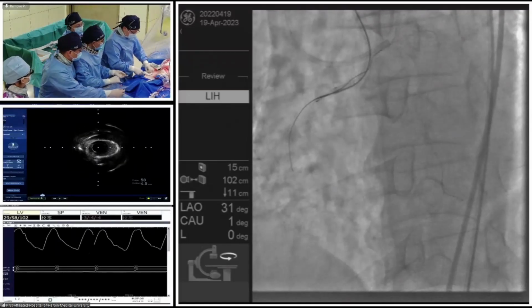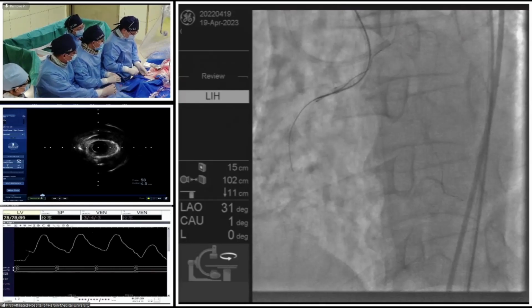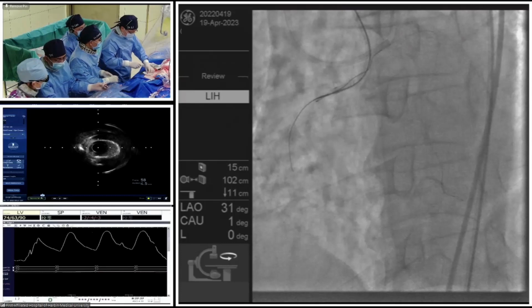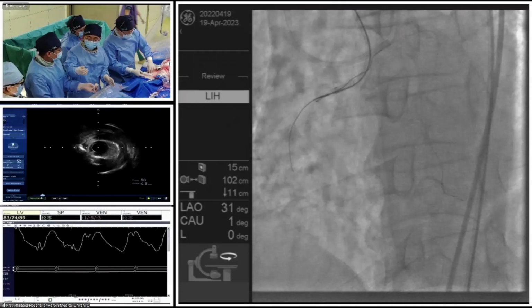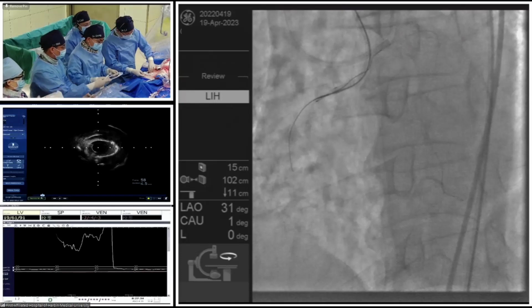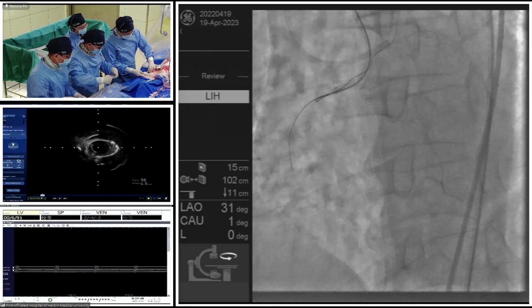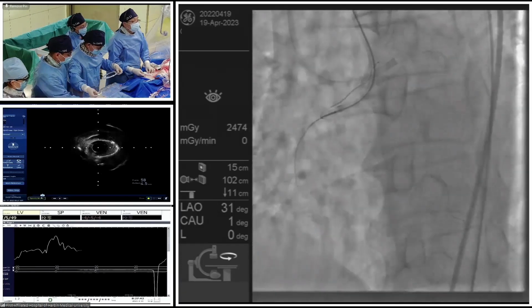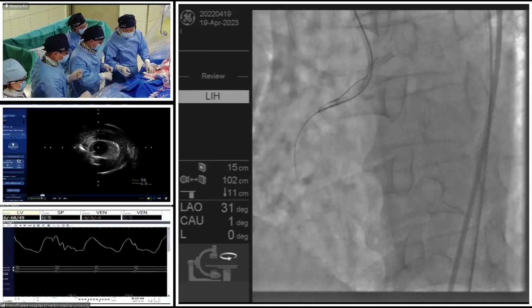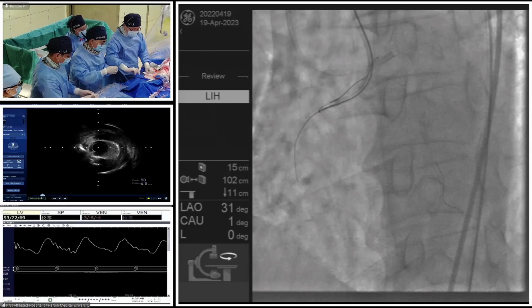So Professor Lee, you just mentioned the concept of vessel architecture. I think this is more and more popular nowadays. We seldom mention the true or false lumen. The concept of vessel architecture increased our choices for strategies in CTO segment. For example, a relatively short segment of subintimal space without losing a very big branch is quite acceptable.